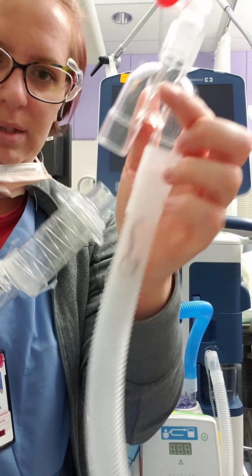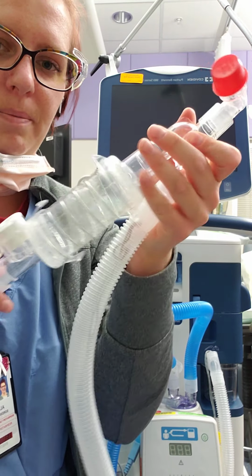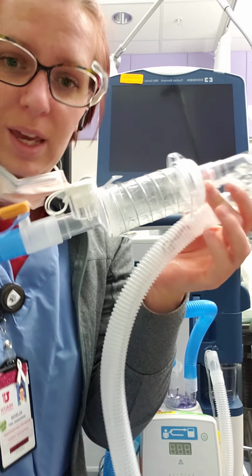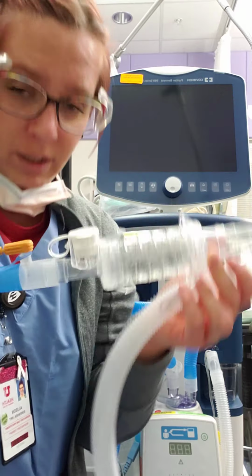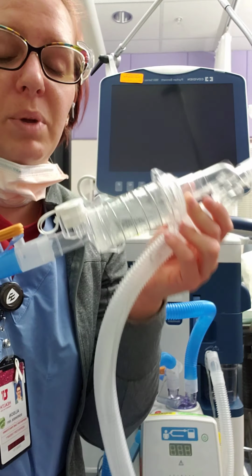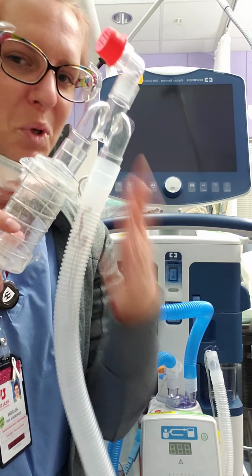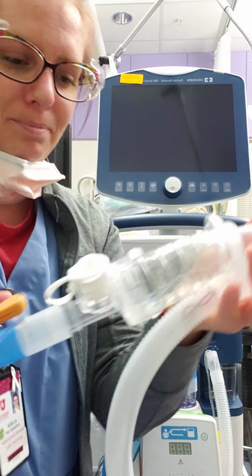And this piece of the Y closer to the patient. And we always place any type of inhaled treatment in the inspiratory limb so that the patient will receive the medication. If you put it on the expiratory limb, it's just going to exhale. The patient will get absolutely nothing.